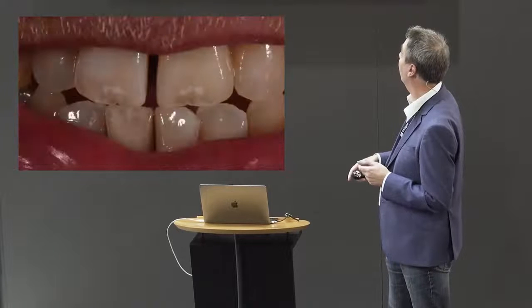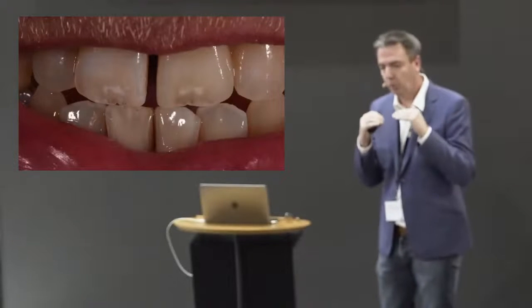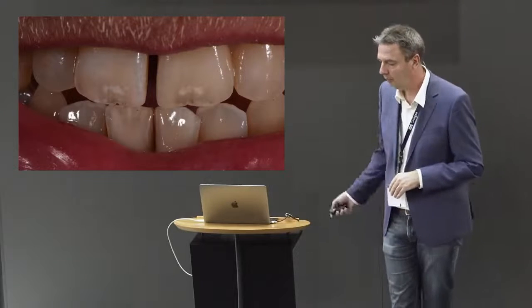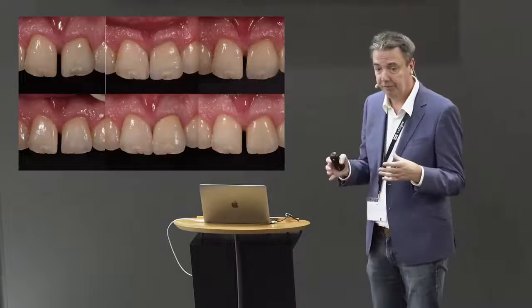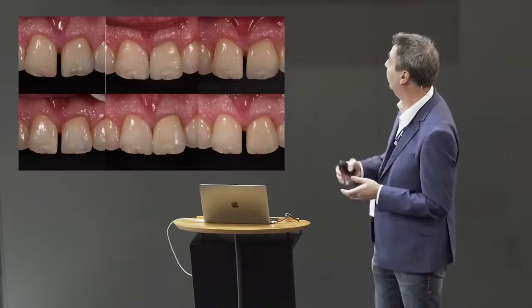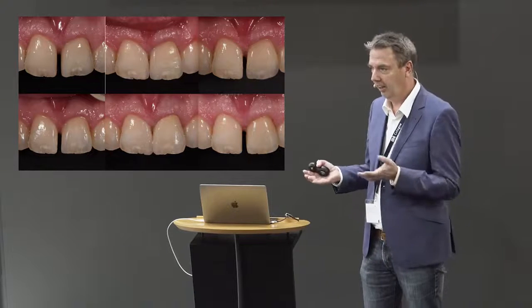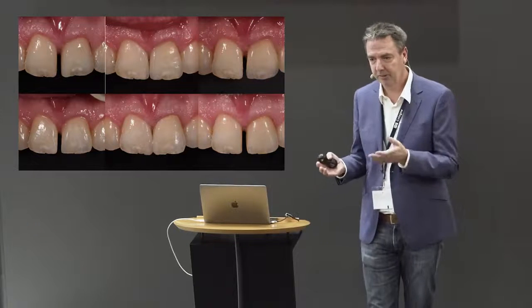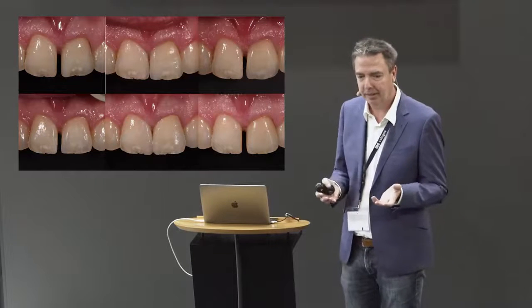And as you can see now, when the patient goes into protrusion, it fits 100%. There's absolutely no risk of fracturing. And finally, this was a live patient course, so we have 6 more results. The patient and I were totally unable to decide which is the best crown, the best case to cement.